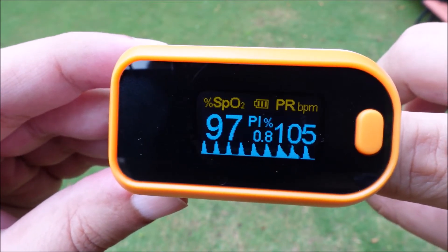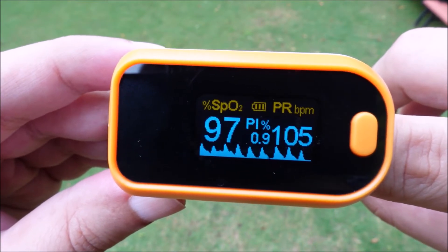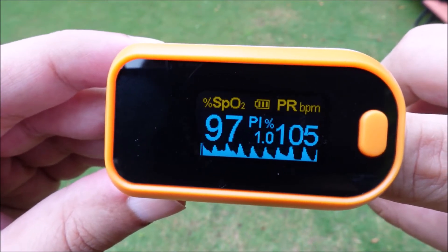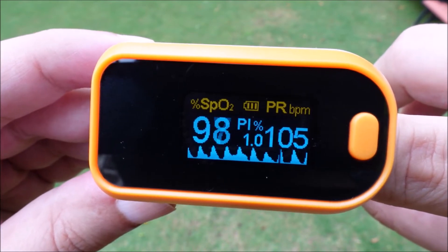If SpO2 is showing below 95, then consult a doctor immediately. Any SpO2 reading of 95 and above is fine.